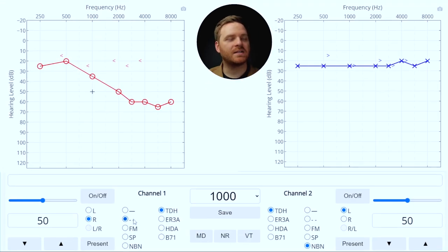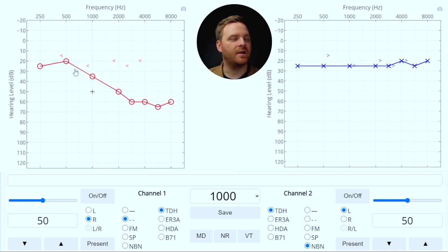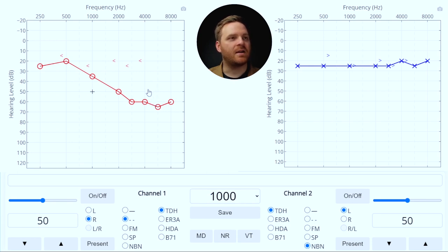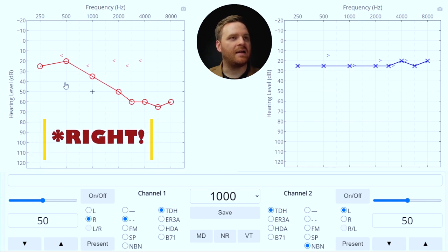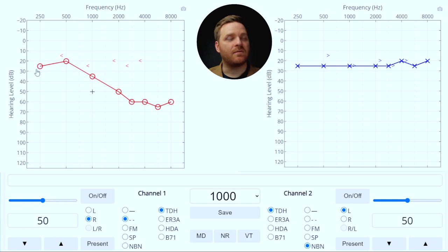When I take a look at this audiogram, the first thing I'm noticing is that the right ear has poorer hearing than the left ear. So my better hearing ear is the left ear and there's something going on in the right — the patient's complaining that the right ear doesn't sound like it used to, muffled, not as clear in the right ear.